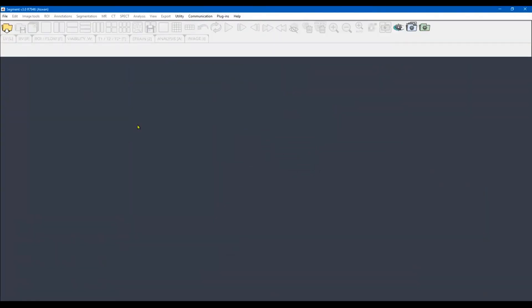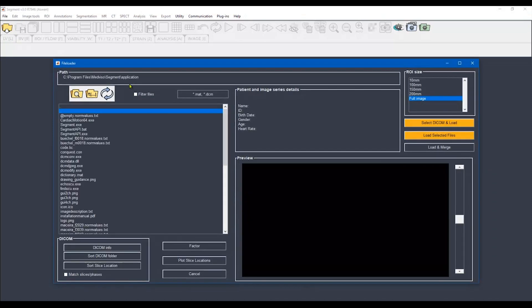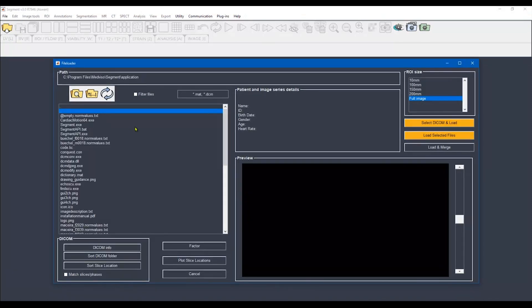This is the interface of the software. It's very easy and user-friendly. We are not going to talk about it right now, so I will go directly to Open Folder to select my CMR DICOM files.